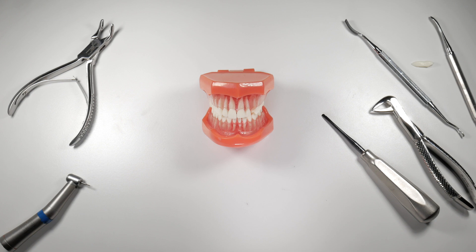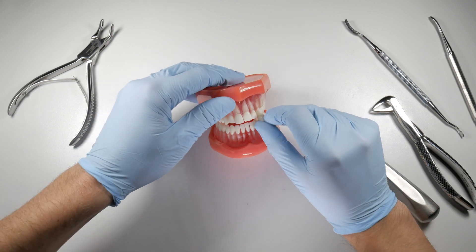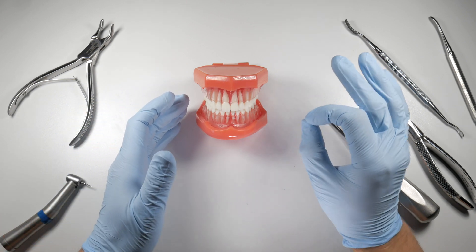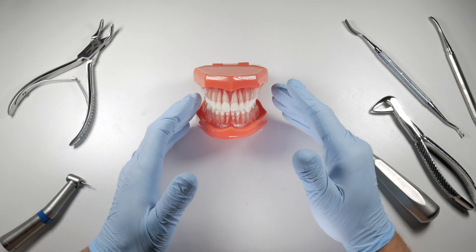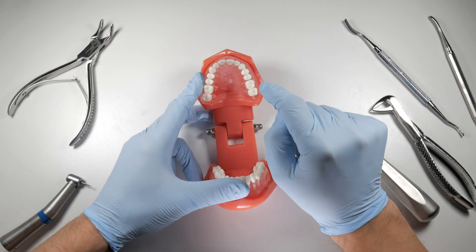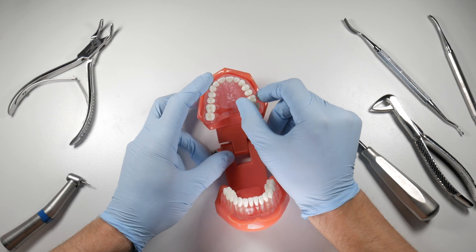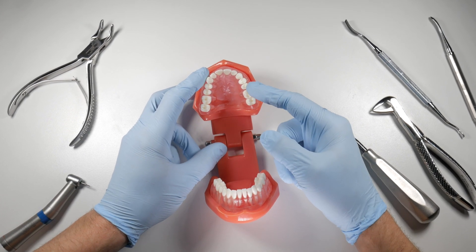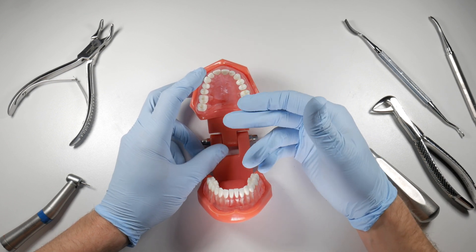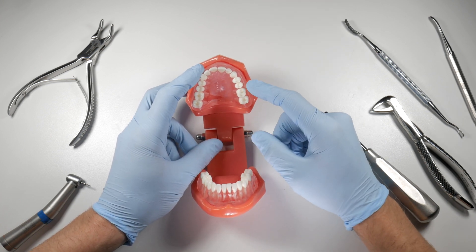As you gain experience taking out more teeth, you'll get comfortable predicting when you're likely to face a buccal plate fracture. For example, with an older patient in their 60s with wide, stiff bone and very divergent roots on the radiograph, you may choose to section the tooth rather than deliver it with forceps. This allows different paths of withdrawal for each root, placing less stress on the buccal plate.